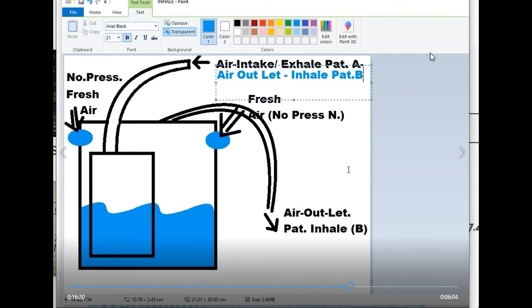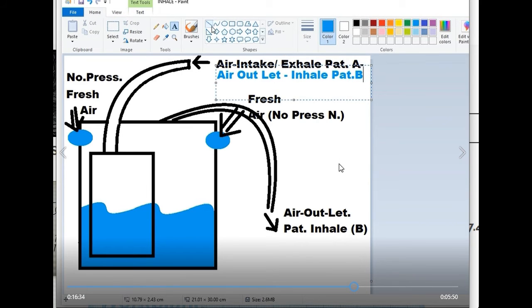Also Patient A atmet ein, which would obviously be fresh air. But as I say, this can be solved with valves. Always remember, patient A is healthy and functioning. He has lots of lung pressure. And here it comes.